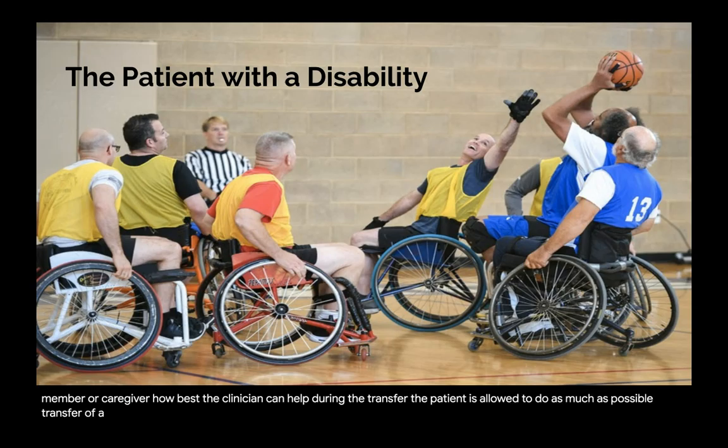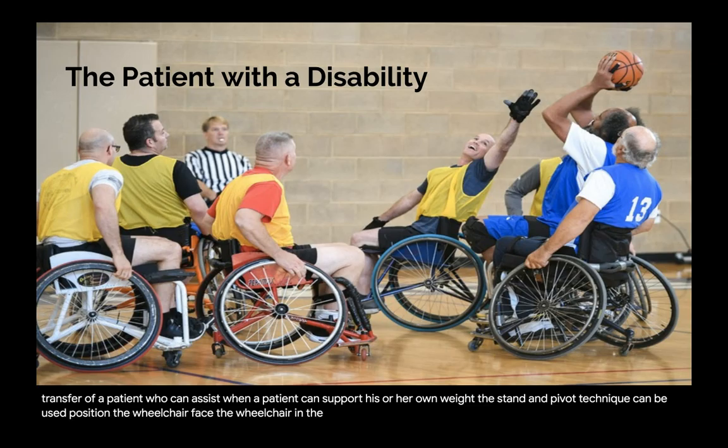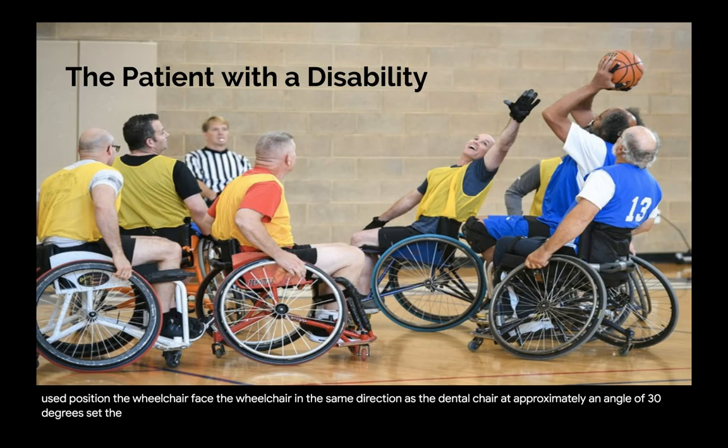Transfer of a patient who can assist. When a patient can support his or her own weight, the stand and pivot technique can be used. Position the wheelchair. Face the wheelchair in the same direction as the dental chair at approximately an angle of 30 degrees. Set the brakes and remove the footrest and wheelchair armrest.